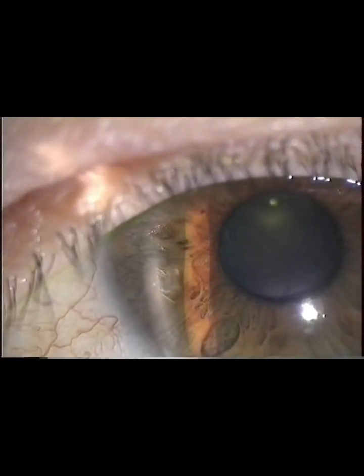This patient has neovascularization from radiation therapy. You can see fine vessels here at the pupillary margin, and on gonioscopy one can see active neovascularization with areas of open angle, but also areas with peripheral anterior synechia. Here we can see an open spot, and now we're drifting into an area that's closed by anterior synechia. One can see the vessels on the surface of the iris clearly here.